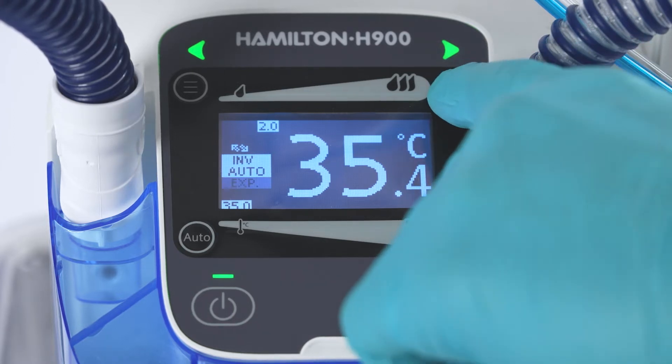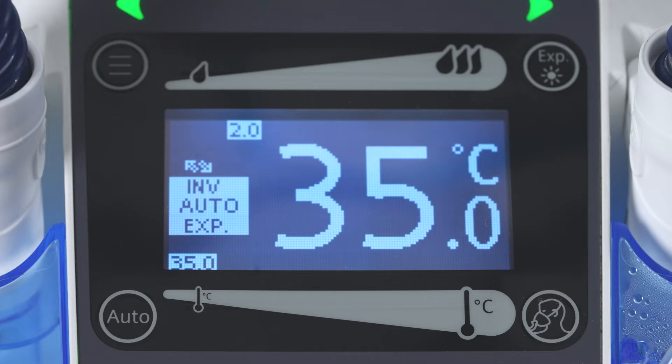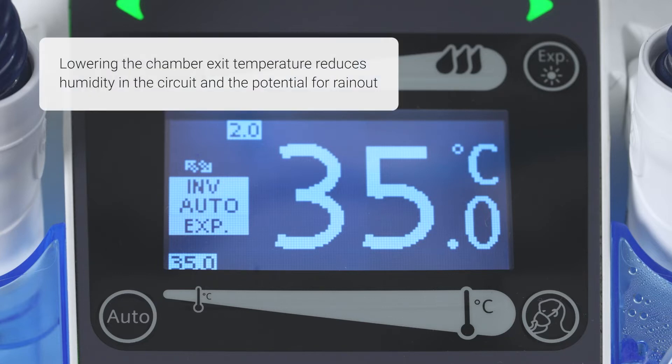use the button EXP to increase the temperature in the expiratory limb to reduce the overall humidity generated and lower the potential for rain-out.